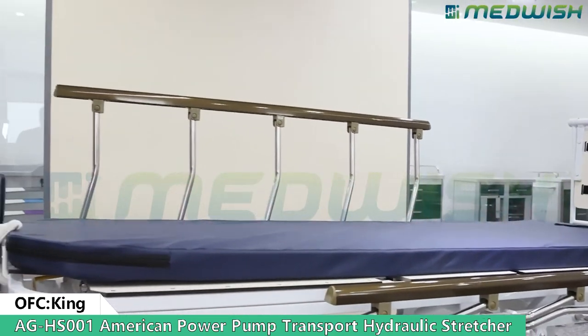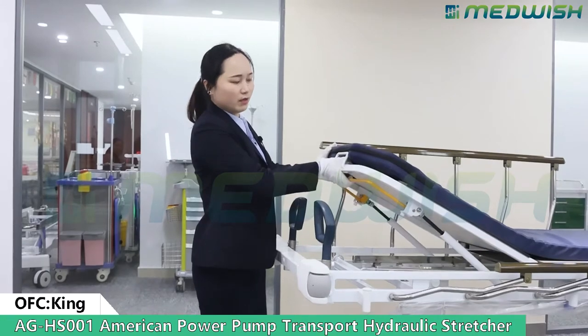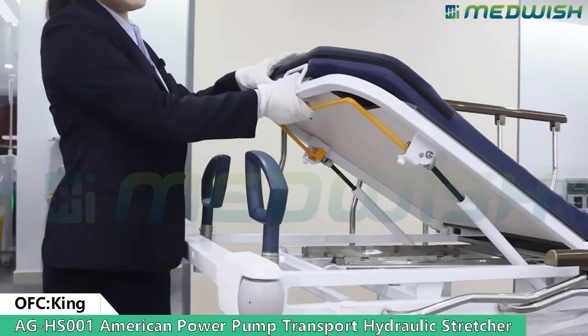For the back section, it is controlled by a gas spring. It can meet the requirement for CPR function very easily.